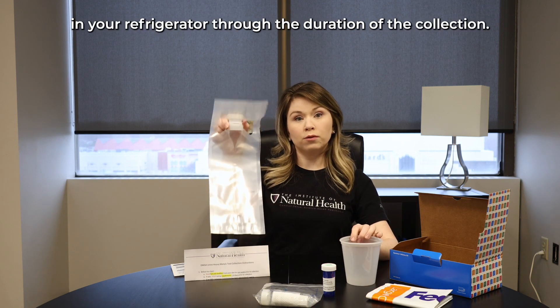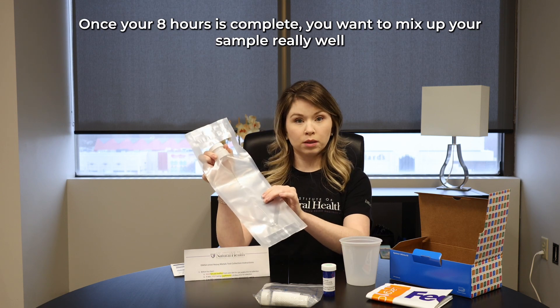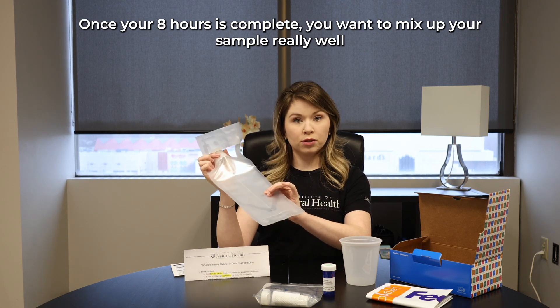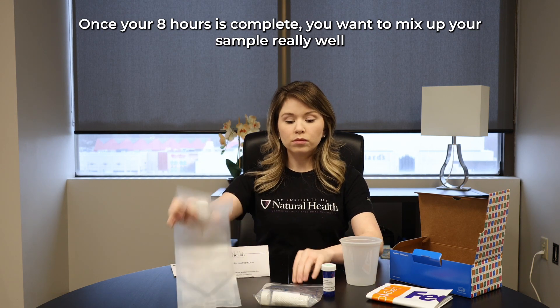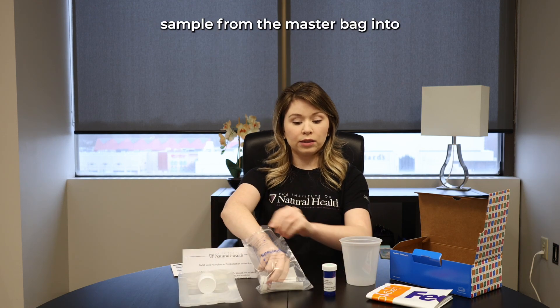You will collect over the course of eight hours. Each time you do collect, you will collect into the urine cup and pour into the master sample bag. This bag will be stored in your refrigerator through the duration of the collection.